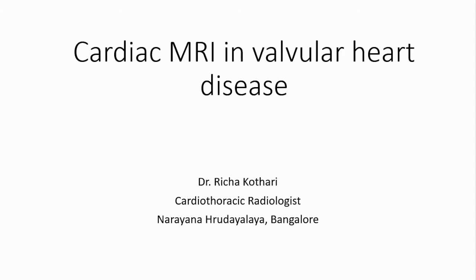Hello everyone, I am Dr. Richa Kothari. I am a cardiothoracic radiologist working at Narayana Hrudayalaya in Bangalore. In this video, I'll be talking about the role of cardiac MRI in valvular heart disease.